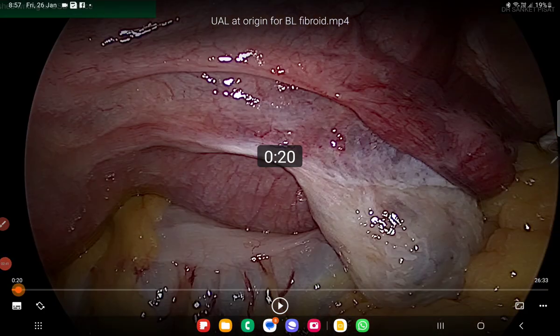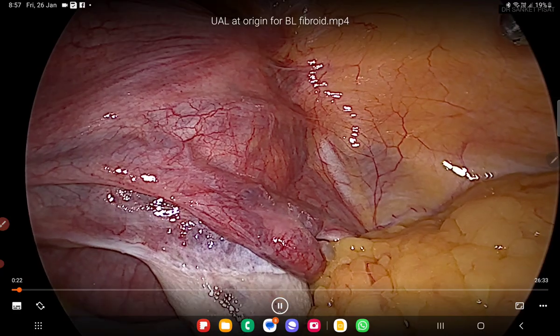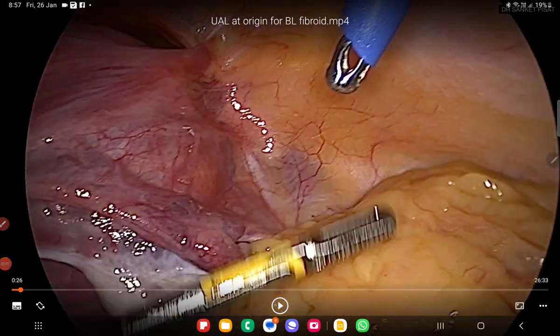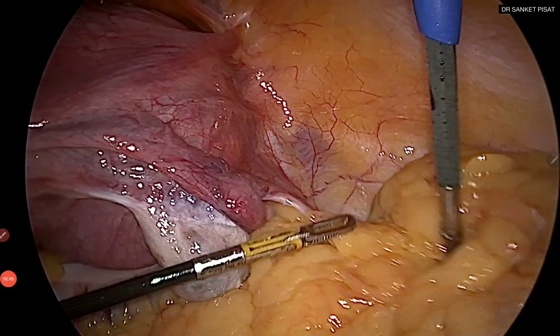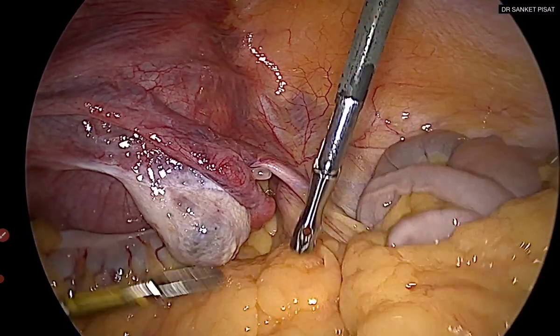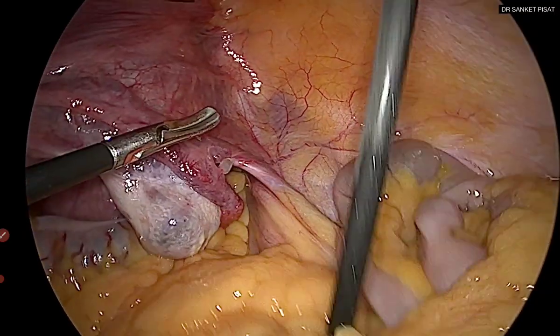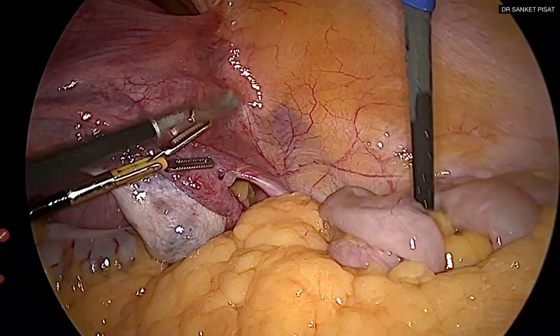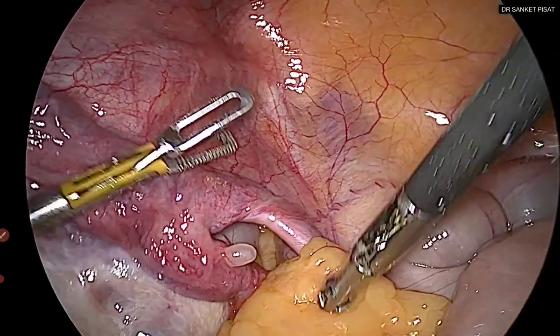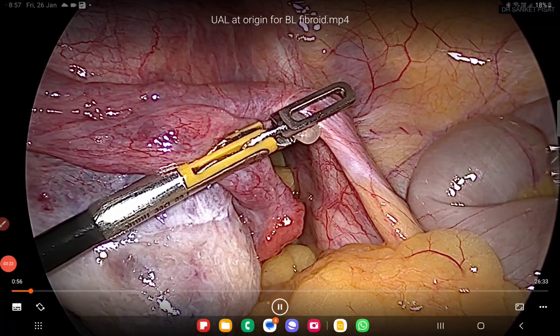In this particular case, when performing the laparoscopic hysterectomy, I am going to have a definite problem reaching the uterine artery on the right-hand side. I may do the cornwal pedicles, but once I reach the level of the uterine artery it may be impossible to coagulate or access it sufficiently to stop the bleeding. That is the main reason why I am planning to do uterine artery ligation at the origin. You can also manage this case using vasopressin and enucleating the fibroid first.